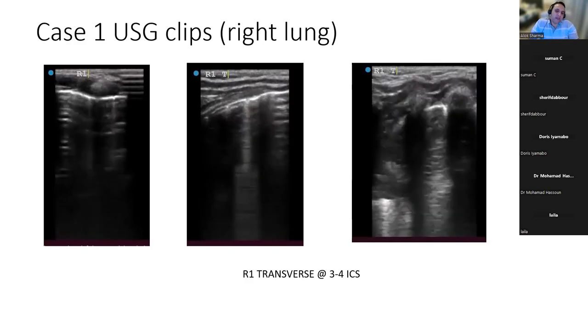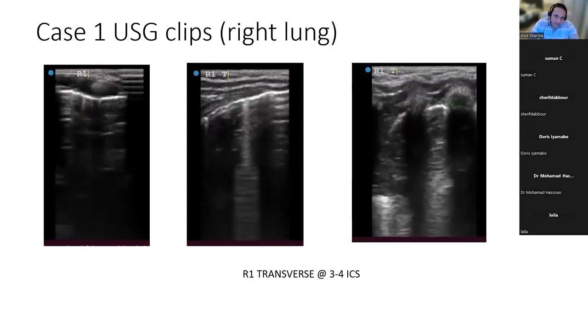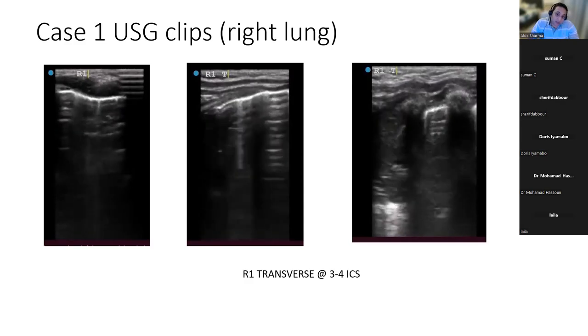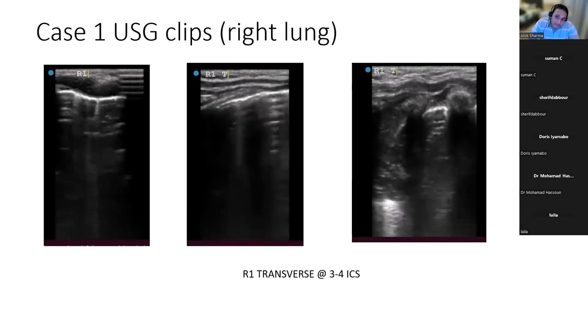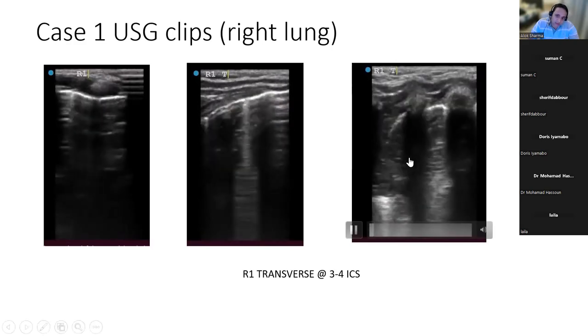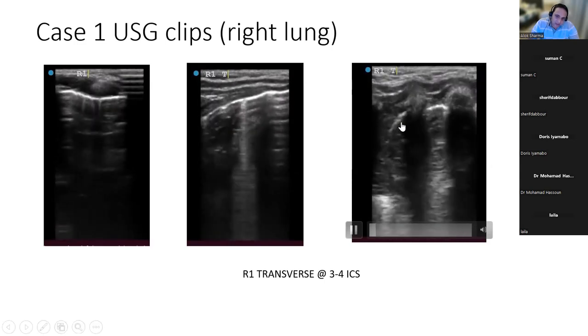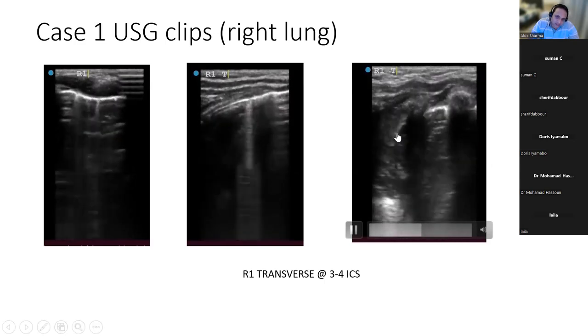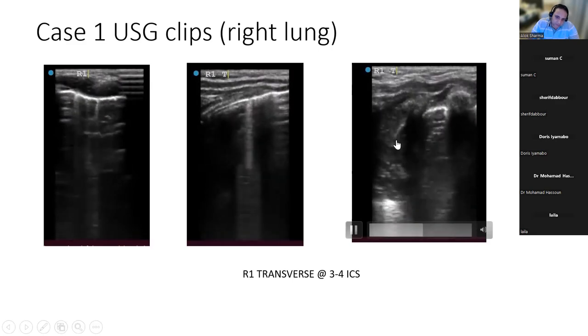The question for me is whether that region there, and I can't see the bat sign well, is whether you've not got any pleura there, and that is atelectasis or thymus, either of the two. Without doing the scan myself, it's very difficult to say. The reason I'm raising the possibility of it being thymus is I can see a blood vessel in the bottom. So if you just come down.